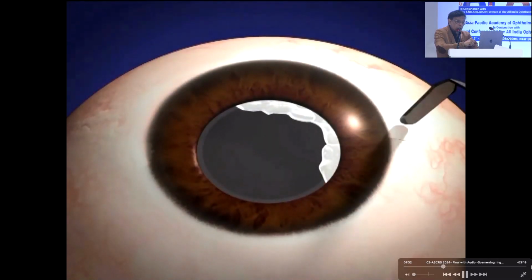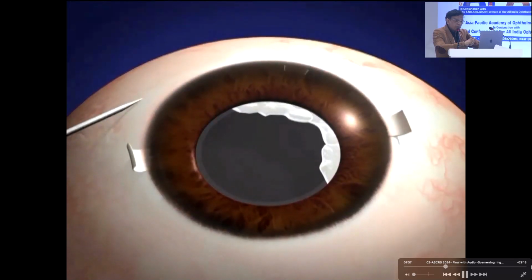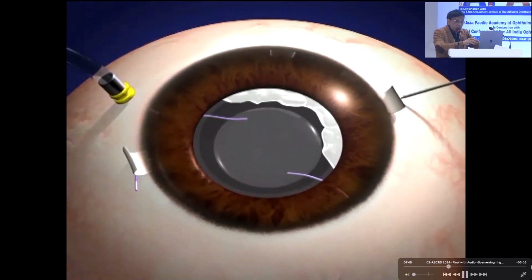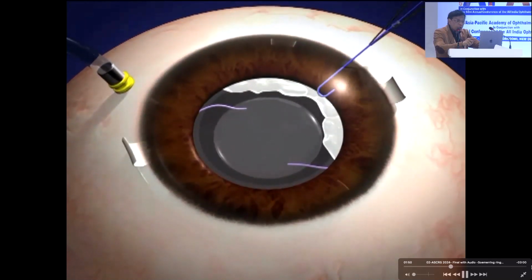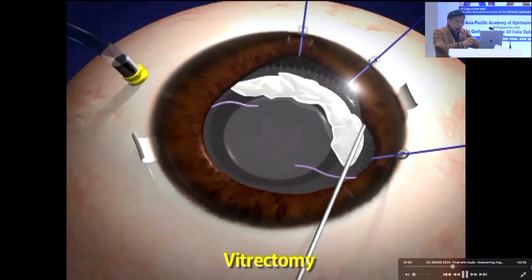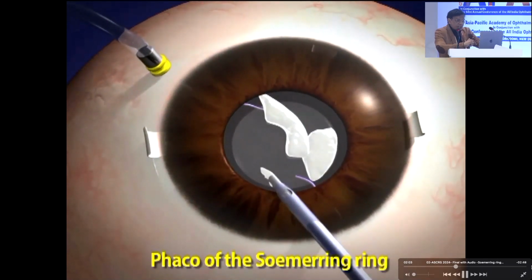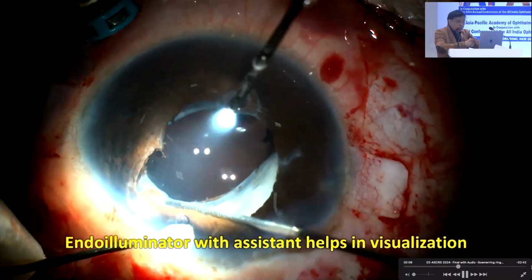So the principle, if you see on the animation, is like this. I made my flaps. I'm going to implant my IOL inside. I'm talking of cases, remember, where there is no capsule, but Soemmering rings are there. So there is no posterior capsule in the central area. Now I have a chance to remove the Soemmering rings without them falling down, because please understand, these cannot come out with a vitrectomy probe. Now you see I'm breaking the adhesions of the Soemmering ring from the periphery, bringing them to the center. Now you can use, as David Chang said, Sue's technique, or use a phaco probe, or just burp them out. Choice is yours.